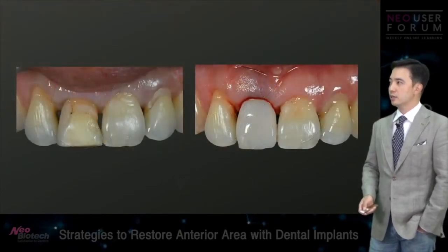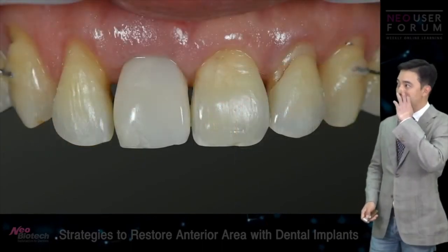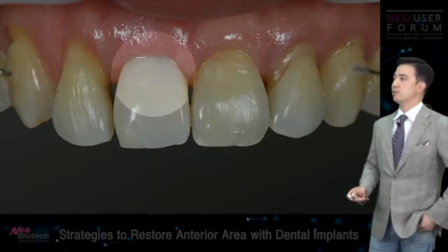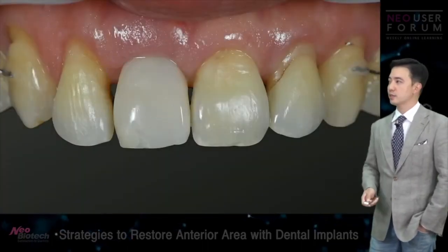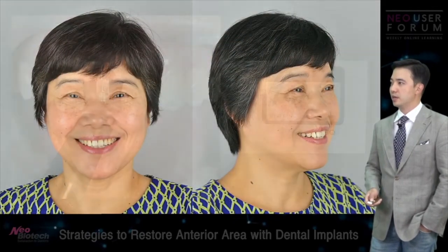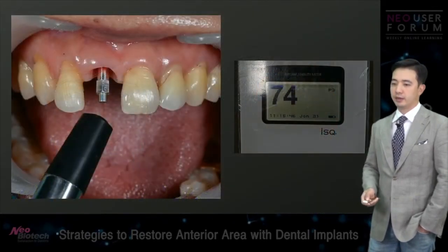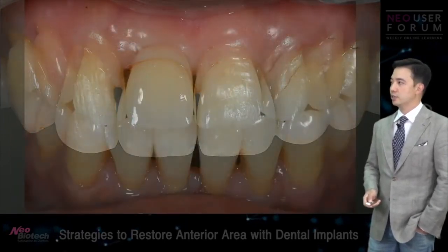out well. So that was the day of surgery, and this is the very next day. See how well the soft tissue healed in one day, right? So the patient was really happy about her smile with the provisional, and then we measured the ISQ value, went ahead, finished the case.